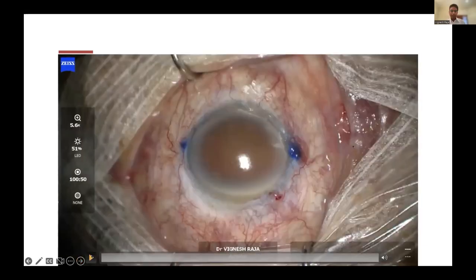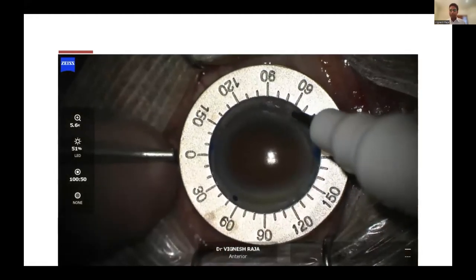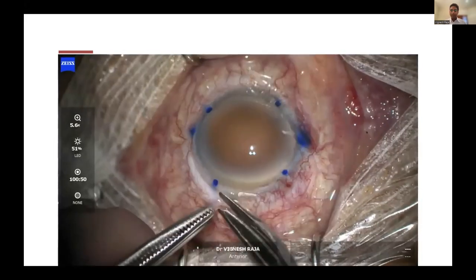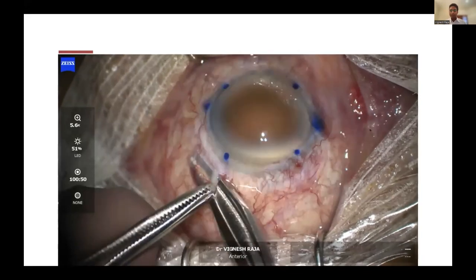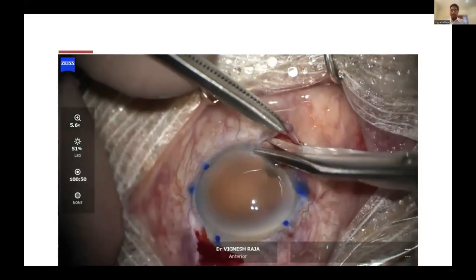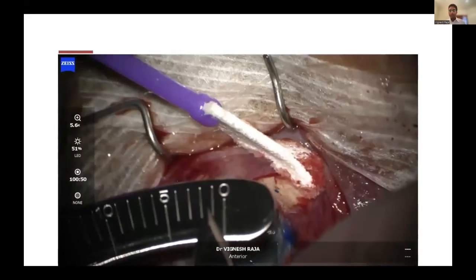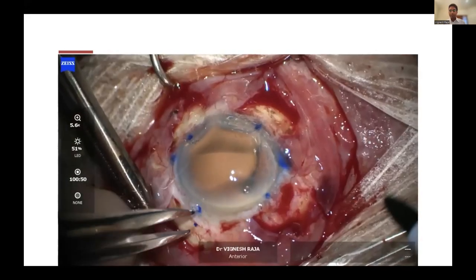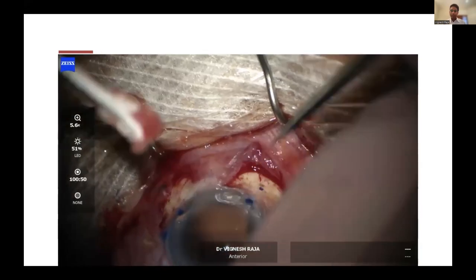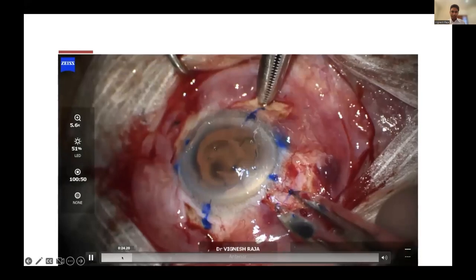Now this case. Here you can see that there is no iris whatsoever. This patient had a penetrating eye injury, and in fact, he lost all of his iris completely. So here, he had quite a high astigmatism of about 4 diopters. So what I'm planning to do is to implant a scleral fixated toric intraocular lens, and then on top of it, use an iris prosthesis as well.